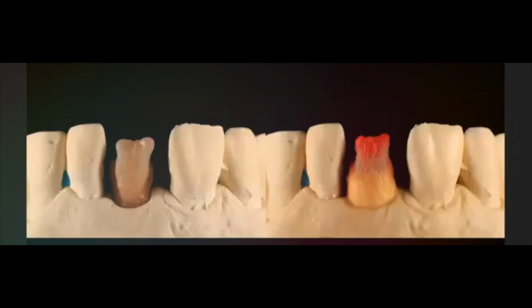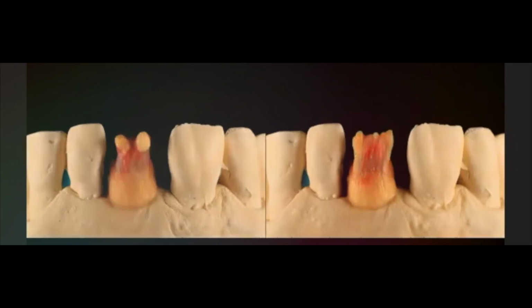and then we start to apply ceramic. First of all, we do some internal stain for the framework, opacious body incisally and cervically.